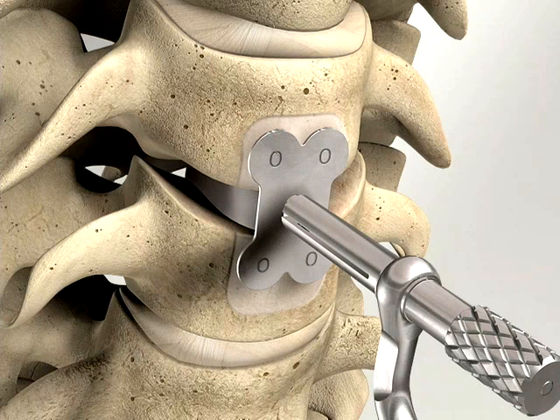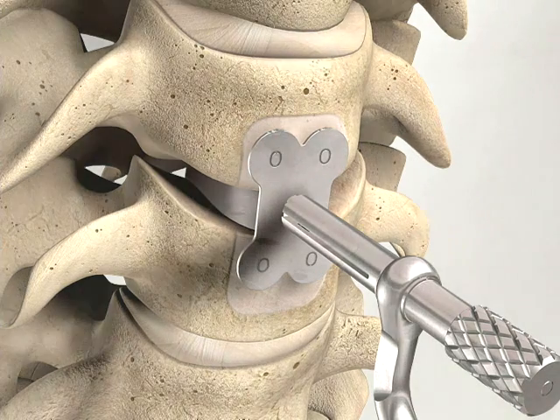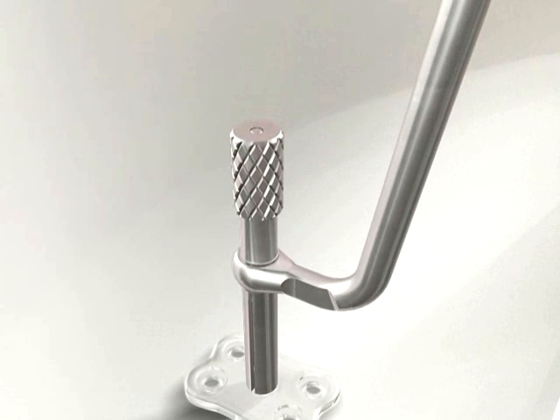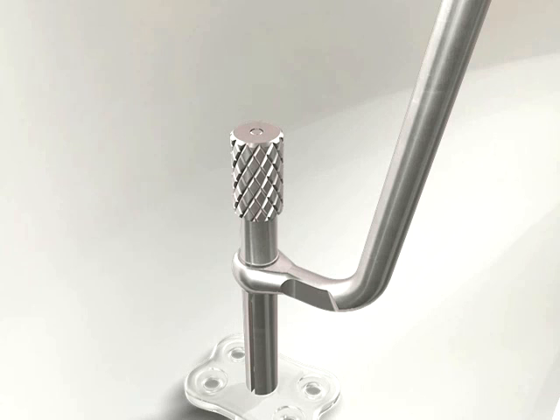The templates can be bent with the plate bending pliers to adapt them to the anterior bone surface. The correct size plate is then attached to the plate holder by positioning the distal end of the plate holder in the middle hole of the plate and gently tightening the screw. The plate's countersinks must be proximal to the surgeon.